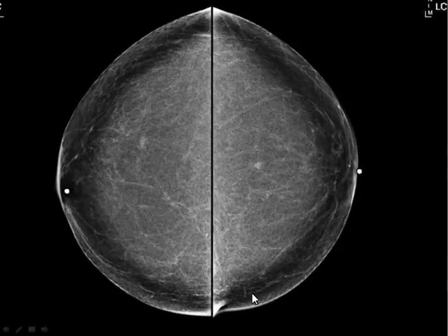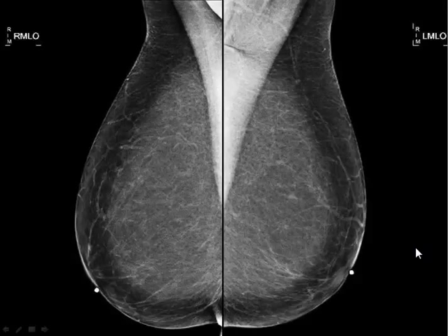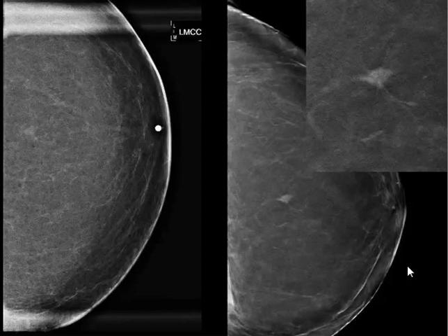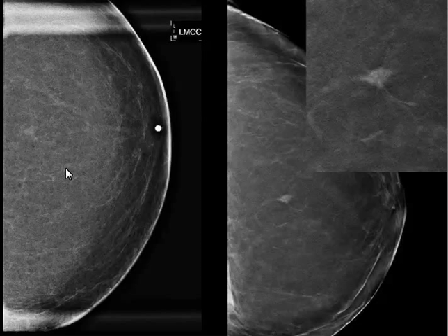Now we have an essentially almost completely fatty replaced breast, with a few scattered densities. This is the MLO view, standard 2D. And here we have, as a comparison, a spot compression view done at the same time when some colleagues were still doing spot compression views. This is the density — it looks more innocent after the spot view.